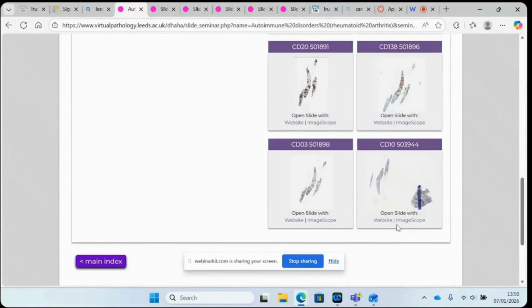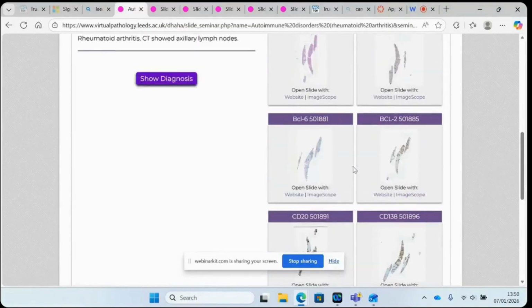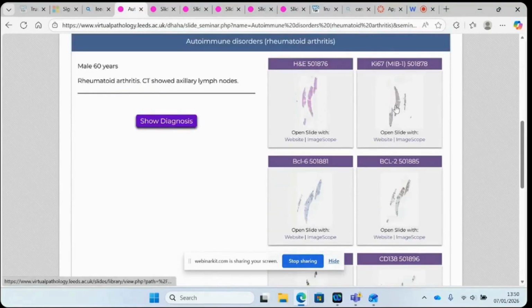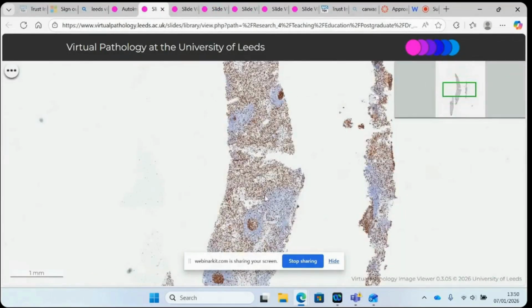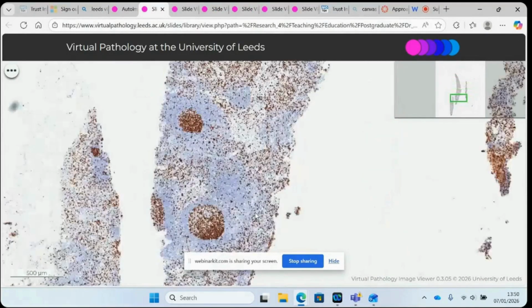Of course, the follicles in Castleman's disease don't look the same as in a reactive follicular hyperplasia. The Ki67 again is high within the germinal centers and does show a degree of polarization dependent on cross-cutting.